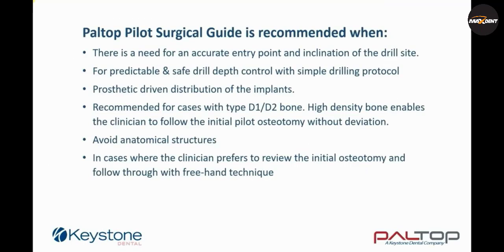When is a pilot surgical guide recommended? When there is a need for an accurate entry point and inclination of the drill site. For predictable and safe drill depth control with simple drilling protocol. For prosthetic-driven distribution of the implants. It is recommended for cases with type D1, D2 bone. High-density bone enables the clinician to follow the initial pilot osteotomy without deviation.